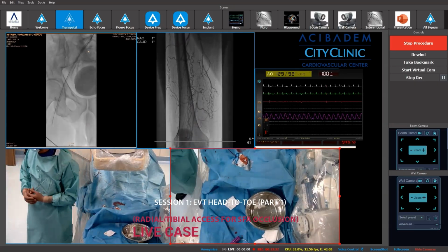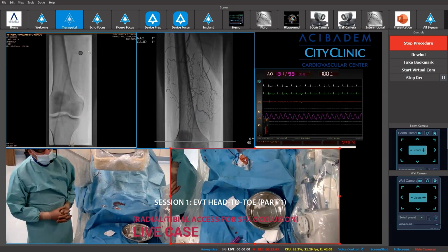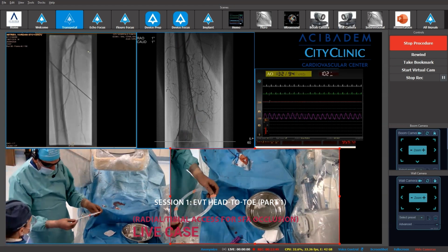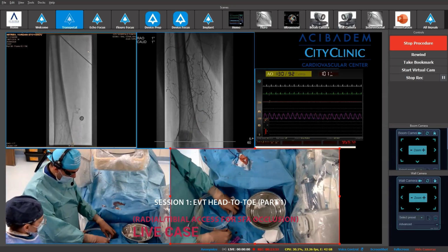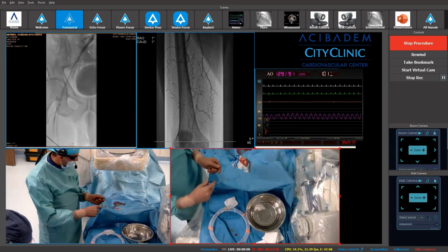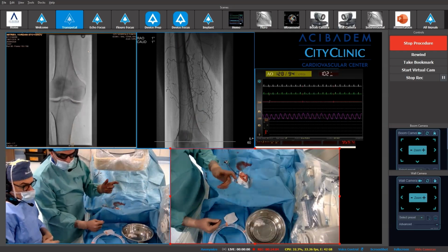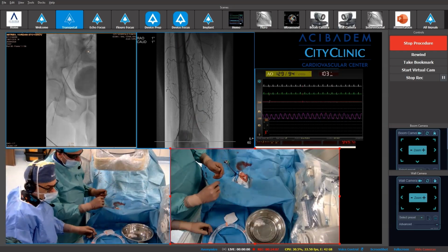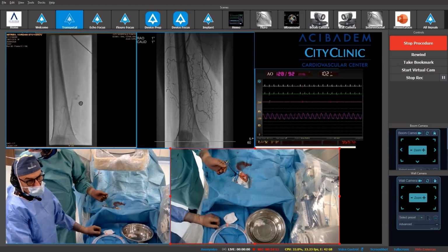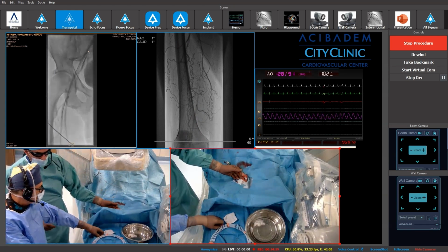Thank you, Dr. Yaneska, for the presentation. Both with my team, Professor Stankov, Lydia, Dani, Iskra, we are going to try to speak and to show our experience regarding the double approach, remote, regarding the 018 microcatheter, Trailblazer.